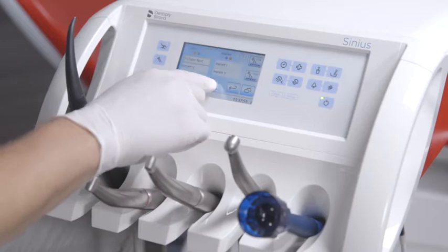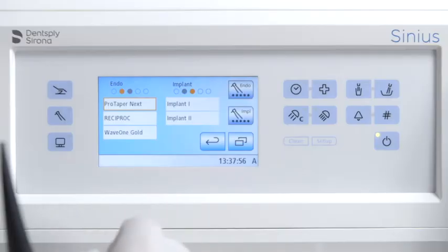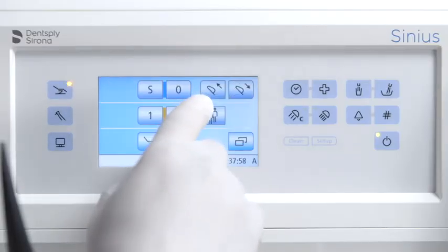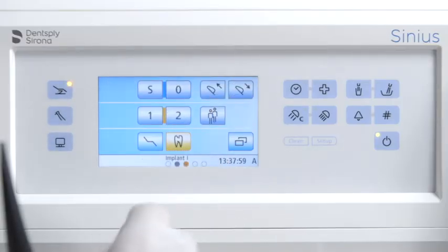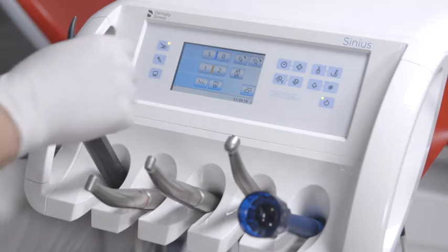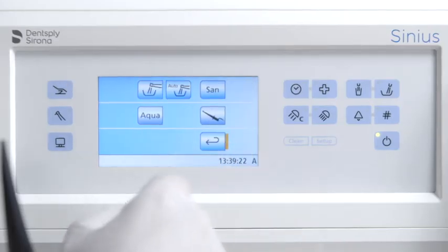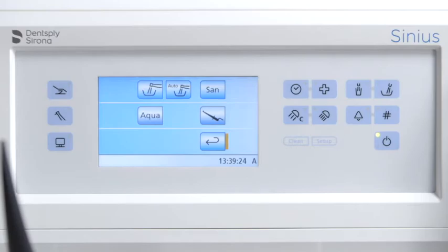The treatment function button is your entry point into implantology or endodontic treatment. The sub-screen button gives you access to additional subordinate functions.